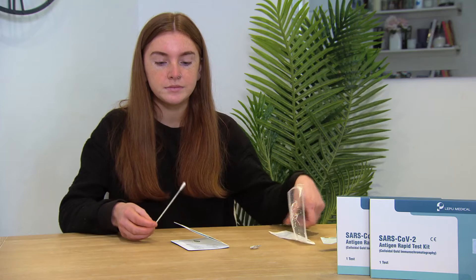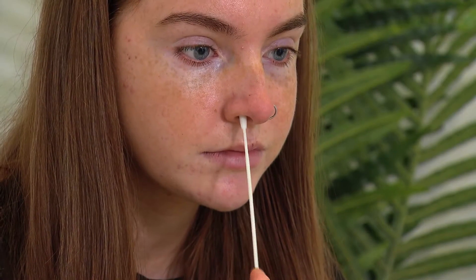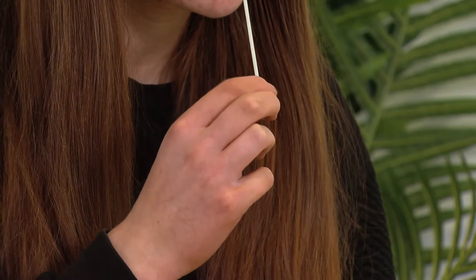Step 2. Remove swab from packaging and insert into each nostril and rotate swab 5 times in both clockwise and anti-clockwise directions.